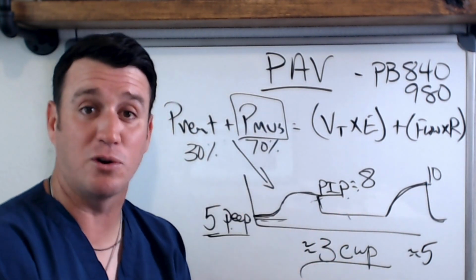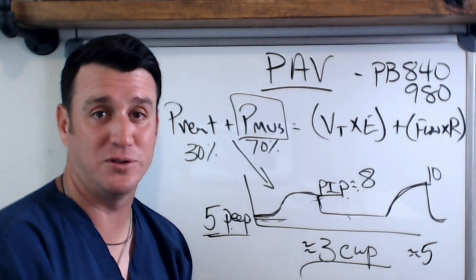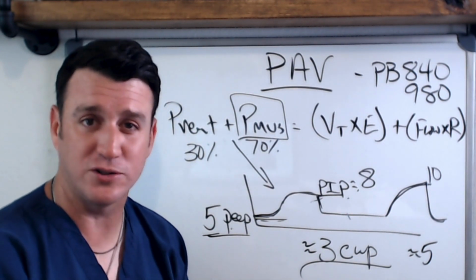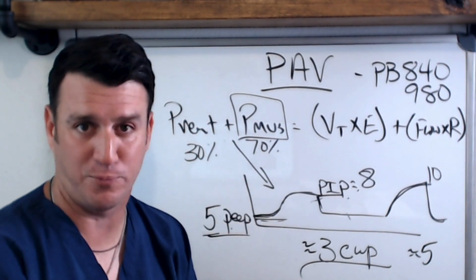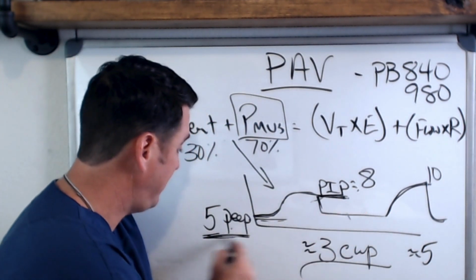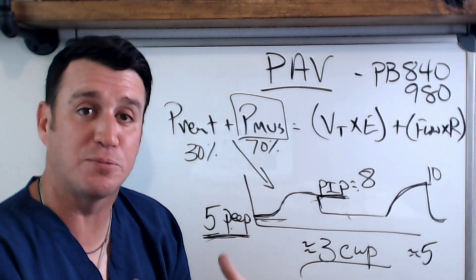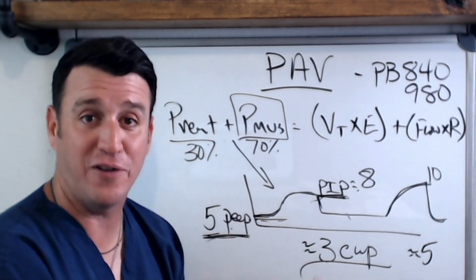And that means the patient is requiring very little pressure support on the inspiratory phase. Okay? So if you ever want to know how much pressure support, or if you want to equate this to some likenesses of pressure support, then you just look at your PIP and you subtract your PEEP, and you'll know the relative difference on how much pressure the ventilator applied during that inspiratory phase.